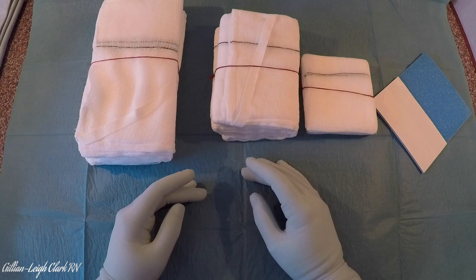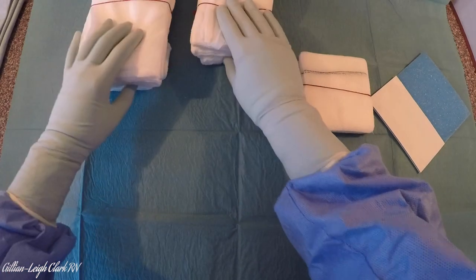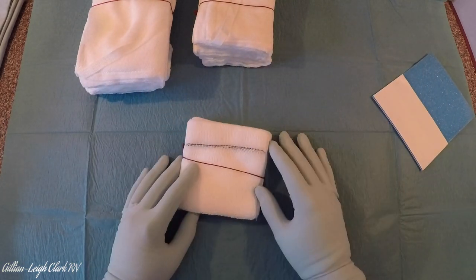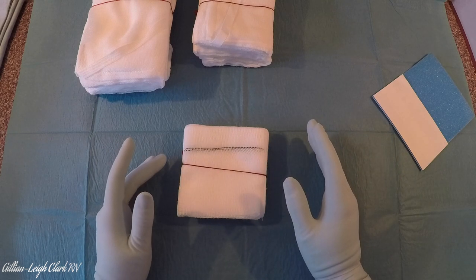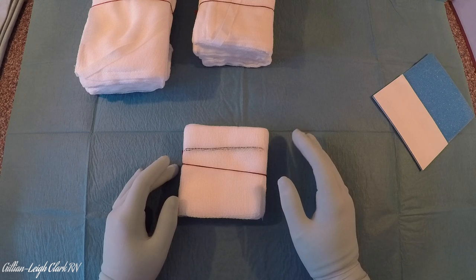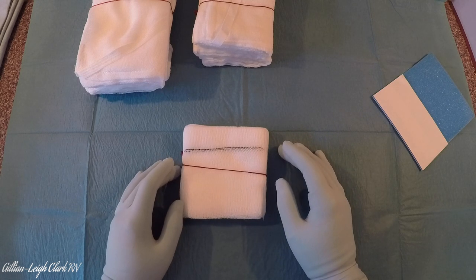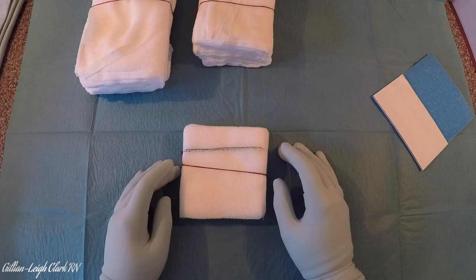Let's start with the small swabs — these are 10x10 Raytex swabs. You need to make sure you've got hold of your floor person to correlate your swab count, so you have eye contact, they're looking at your swabs, you're looking at your swabs, and everybody's on the same page. Ideally you shouldn't start counting swabs unless you can finish that count. Obviously emergency situations arise and you'll have to use your professional judgement, but your gold standard is that you have two people counting the swabs and you're both correlating visually.